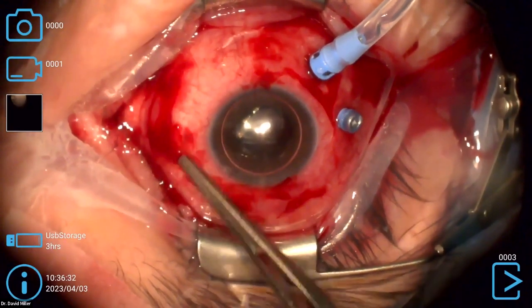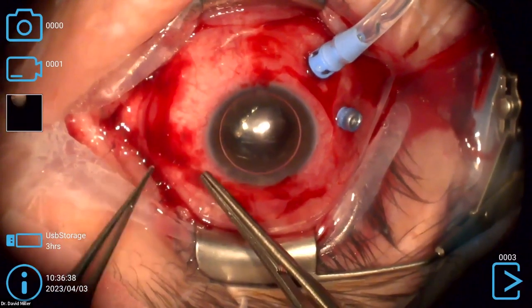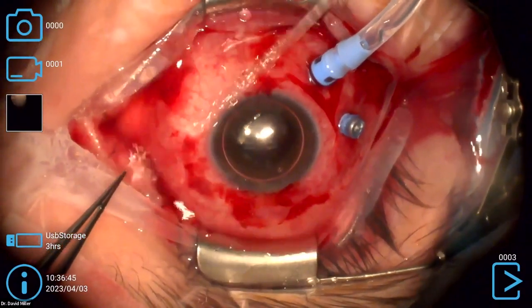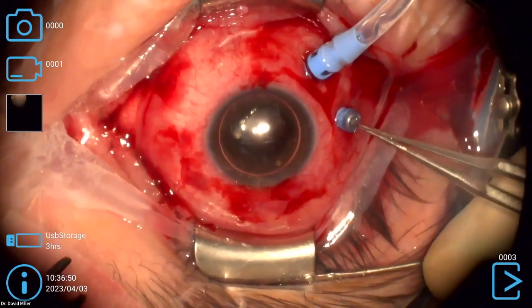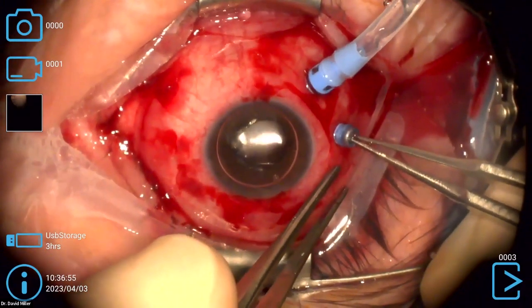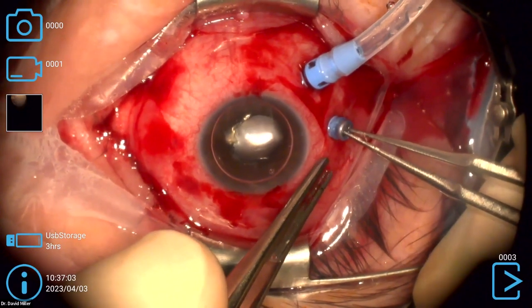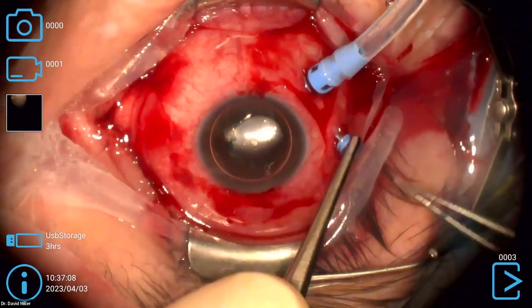Now let's close this one up. I'm sure you got a 0.12 there. So we're going to press down on this guy. This eye, just friable tissue everywhere, very inflamed, multiple surgeries. Let's go ahead and put the gas bubble through the SF6. I'm venting the sclerotomy here by putting the 0.12 forceps in and just letting them kind of passively open. 40. Okay, and we'll pull that one out.